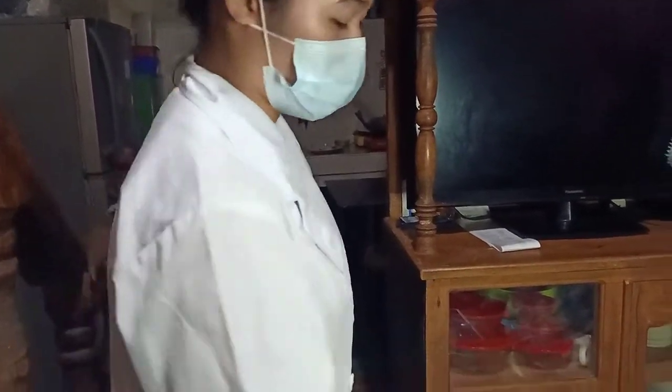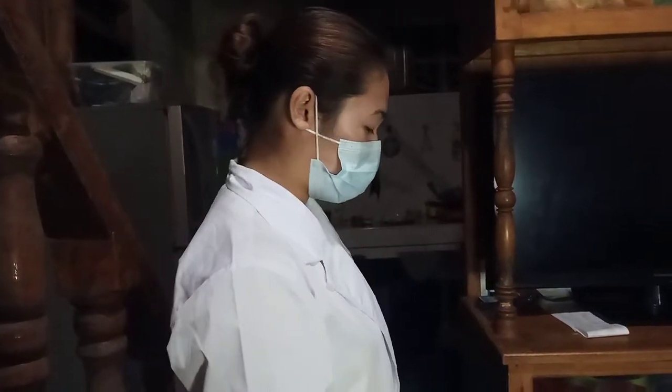And place this syringe in the hypodermic tray. And write on the medication label the name, dosage, and the frequency.